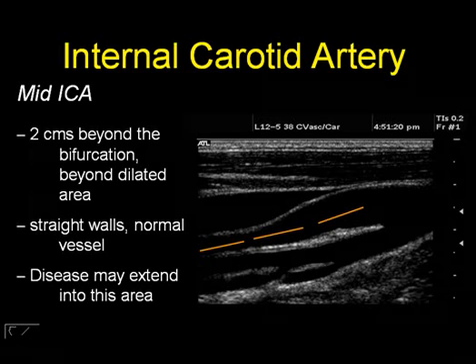And this is important because you don't want to make the mistake of diagnosing a high velocity as an atherosclerotic plaque in the absence of plaque in other places. Now, you can absolutely have pathologies out in this area, typically not referable to atherosclerosis, especially, again, when there's no disease anywhere else. But for instance, if a patient comes in after a car accident and maybe has a seatbelt injury or has some trauma to the neck where you're eliciting a focally elevated velocity in this area, it's more likely to be a traumatic injury such as a dissection or an intimal flap rather than an atherosclerotic lesion. And this does make a difference in terms of treatment for that patient.